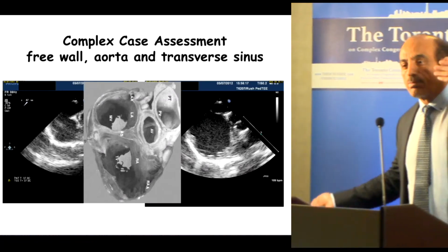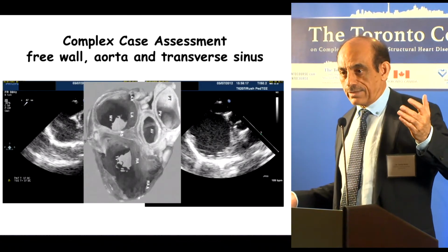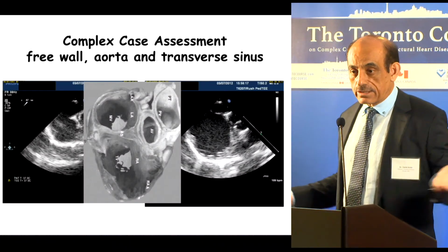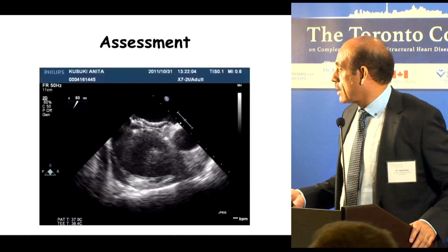So we don't pay attention to this. I do. Whenever I look at it, I want to look at it. After doing 2,200 plus ASD, I never had erosion. So either I'm the luckiest man alive or I'm doing something right. It's one of the two.